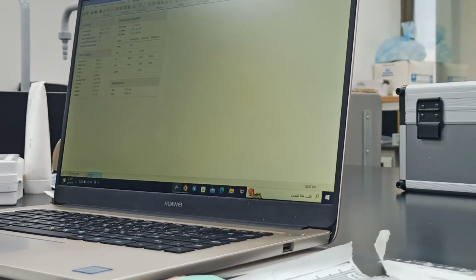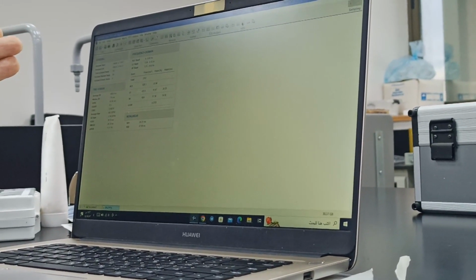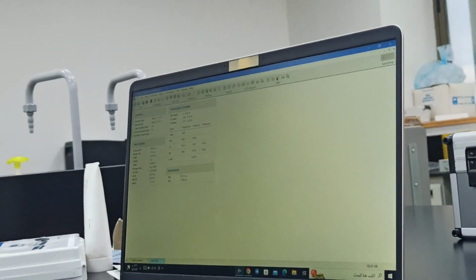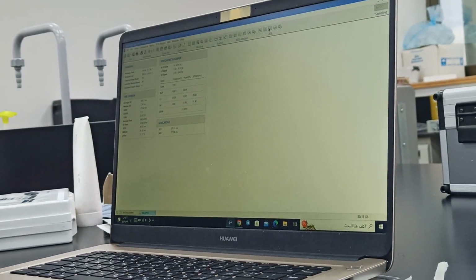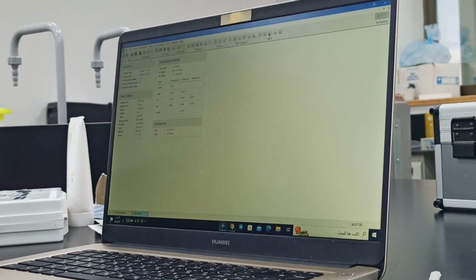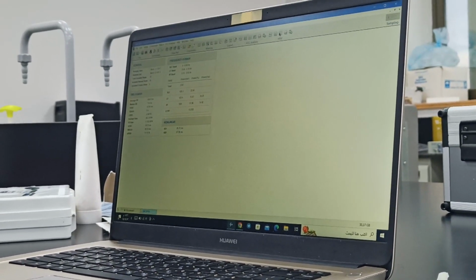That's why we need the full 5 minutes. This is the standard thing you will have to report. We can try smaller ones at places where we have some disturbance in the ECG and we cannot get 5 minutes, like 4 minutes. But keep in mind that we should have 5 minutes.